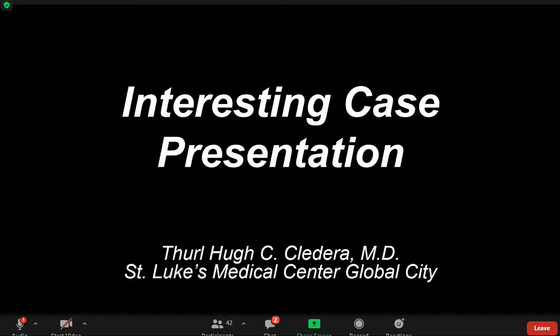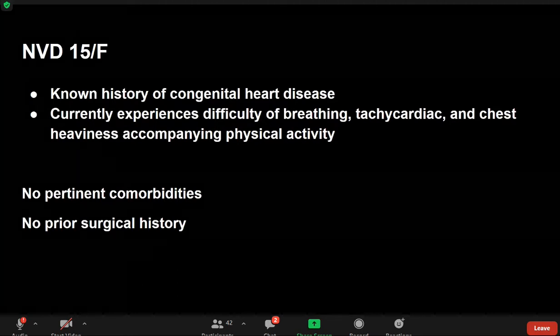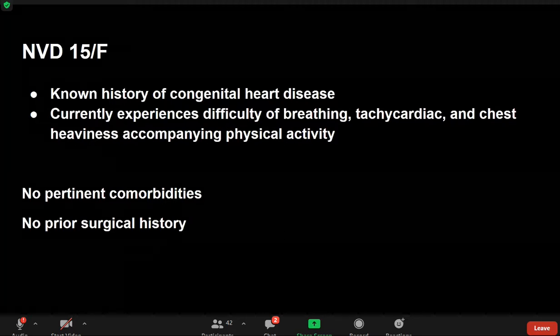Hello, good afternoon, everyone. So I'm here to present my interesting case presentation. We have a case of NVD, a 15-year-old female. She had a known history of congenital heart disease, currently experiencing difficulty of breathing, tachycardia, and chest heaviness accompanying physical activity. She had no pertinent comorbidities and no prior surgical history. She also didn't have any prior imaging. She came to our institution for a cardiac MRI.